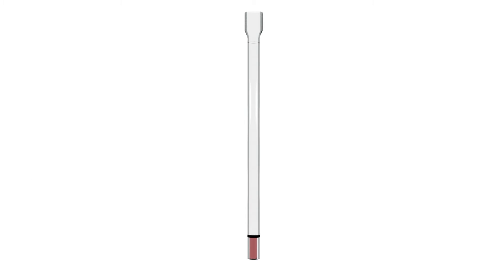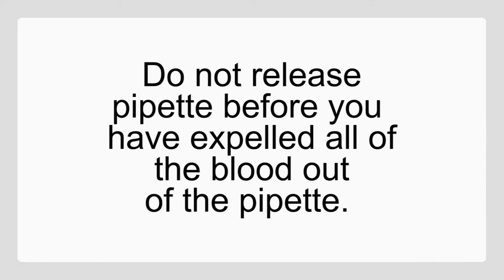There is still blood in the capillary pipette. You can use your other hand to put more pressure on the tube. Once you release the pipette, it is very hard to get the blood out. Do not release the pipette before you have expelled all of the blood out of the pipette.